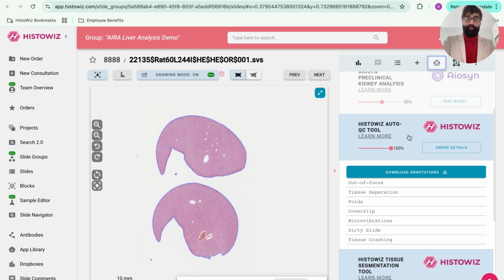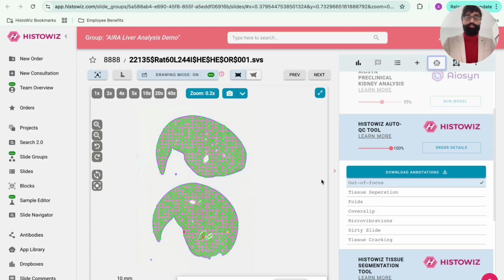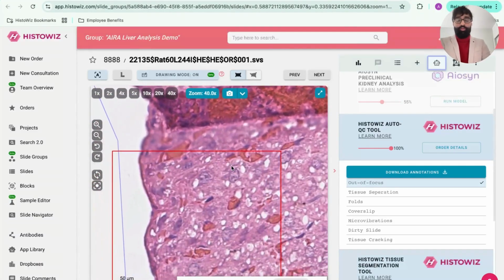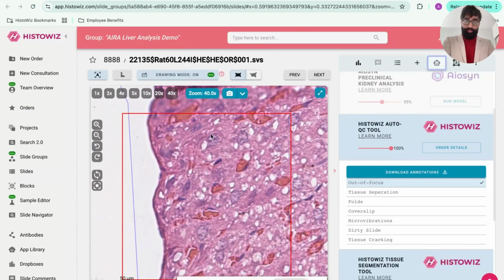So as a part of that, we have out of focus to detect tissue blur, cover slip, tissue dirt, tissue cracks, etc. And once you click on any of that feature, it populates with bounding boxes where green indicates there is no issue and red indicates there's a significant issue. And again, tissue blur is something which is not clearly visible at lower resolution. So an AI app for that actually makes it easy to look for anomalies across the image. For example, here it flags that there is one region which has blur, and as you zoom in at a very high resolution, indeed there is a small blur within the tissue.